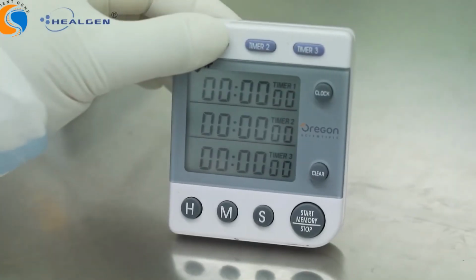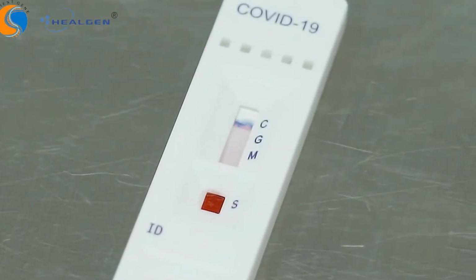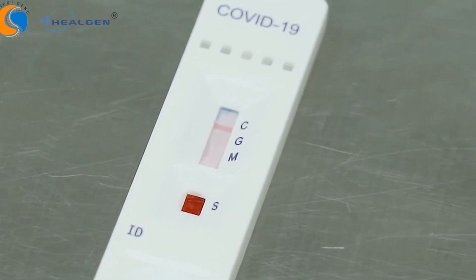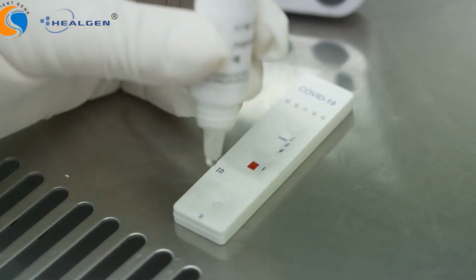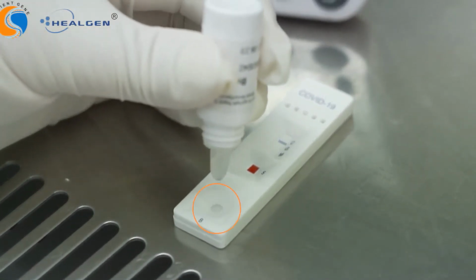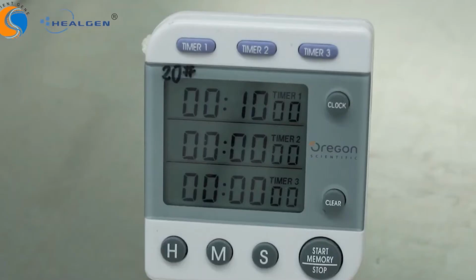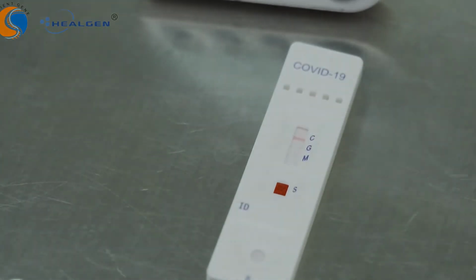Start the timer. If after 2 minutes the sample has not moved across the test window or if blood is still present in the sample well, add 1 additional drop of buffer to the buffer well. Read the test result in 10 minutes. Do not interpret the results after 15 minutes.